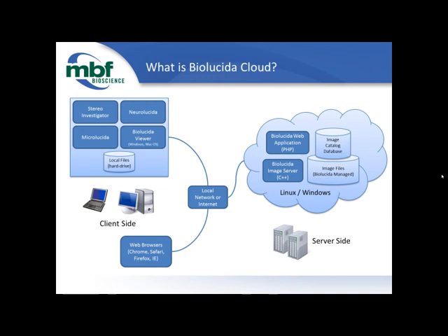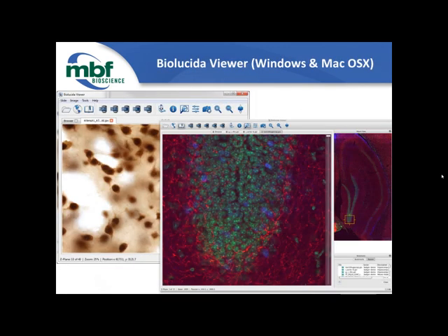Sure. So, Jeff, okay, thanks. That's a pretty good explanation of the layout of Biolucida Cloud. But now let's jump right on into the next section, which is going to be viewing images.